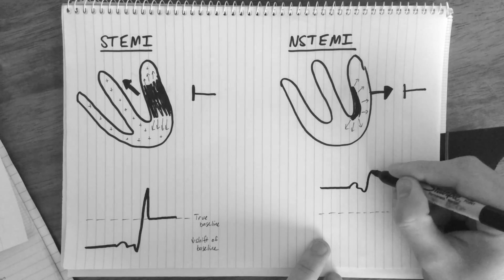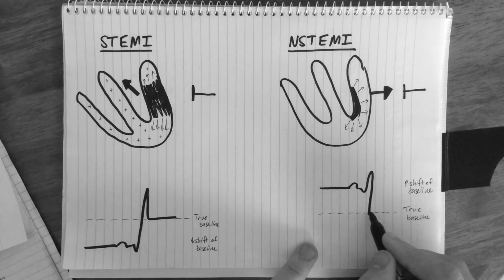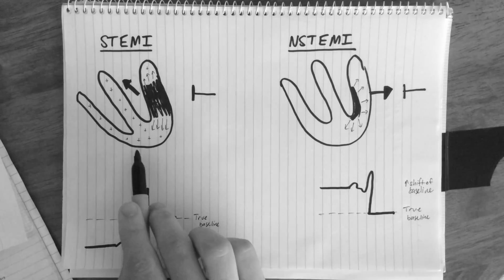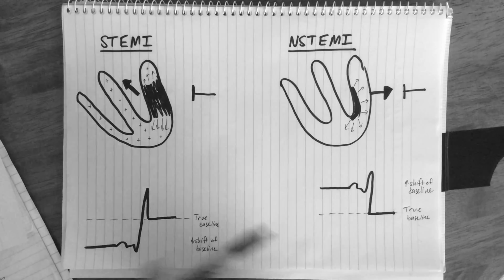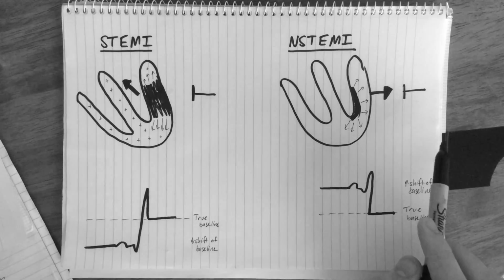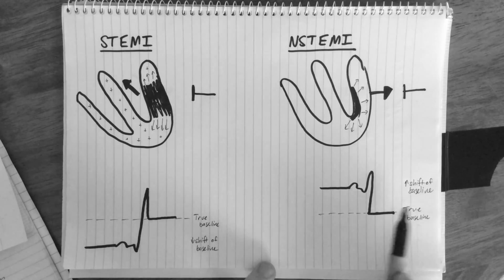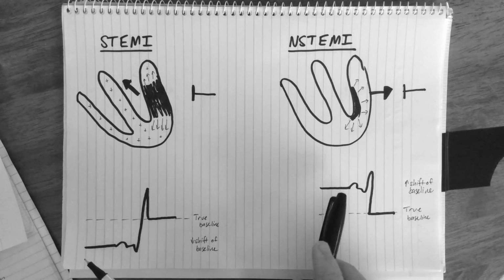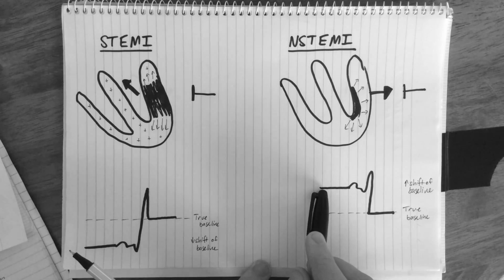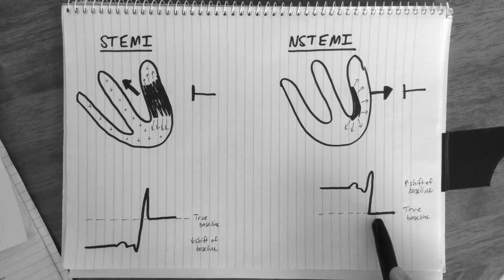P wave, QRS complex, everything seems normal until we get to the ST segment. As I mentioned before, between the QRS complex and the T wave, the myocardium is completely depolarized. So we would expect the electrode to show a reading of 0 volts, and this would be reflected by the ST segment being on the isoelectric line. But because the baseline has abnormally been shifted upwards, the ST segment, reflecting a voltage of 0, appears depressed.